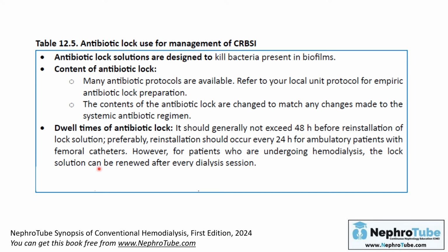But if the patient has a femoral catheter, the dwell time must be only 24 hours. So we have to change the antibiotic lock every 48 hours for subclavian and internal jugular catheters, and for femoral catheters it must be every 24 hours for ambulatory patients with femoral catheters.